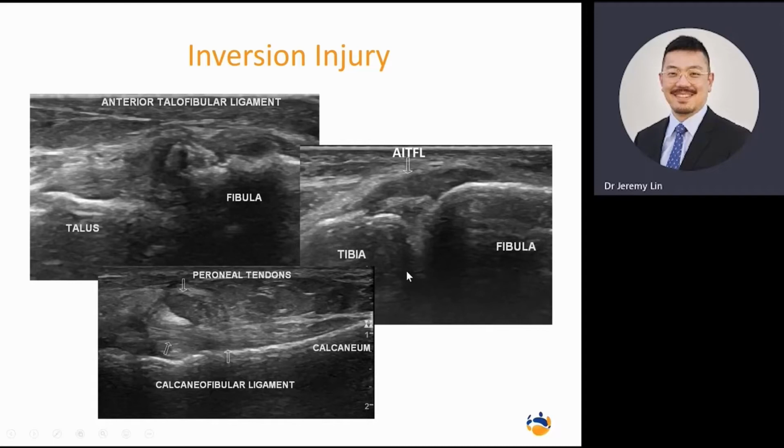So going back to what I was saying before, if at the same time we have X-ray and ultrasound, it gives you a much better clinical picture of just how bad the injury is, because a twisted ankle is not the same for everybody. Some can be, it's just a sprain. Others can be, we really need to go and see a surgeon now. But if we have the ability to do both X-ray and ultrasound, it gives us a picture of both the hard or the bony injuries and the soft tissue injuries at the same time.